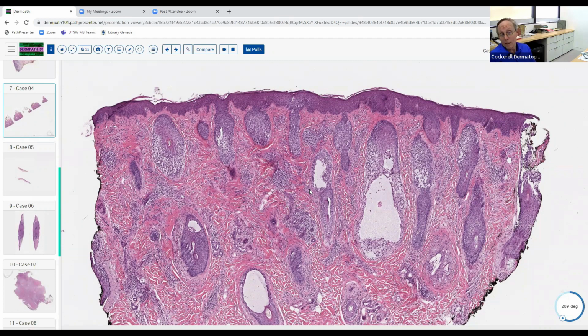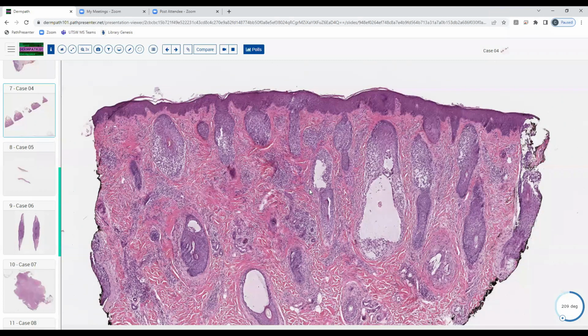but can you tell us a couple of others? You may not know this because it's relatively uncommon, relatively rare, but there are a few other situations where you can see follicular mucinosis and it's neither of those conditions. I'm not sure. Yeah, I'm not surprised because it's fairly uncommon.